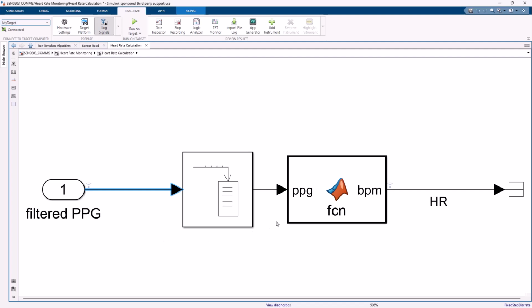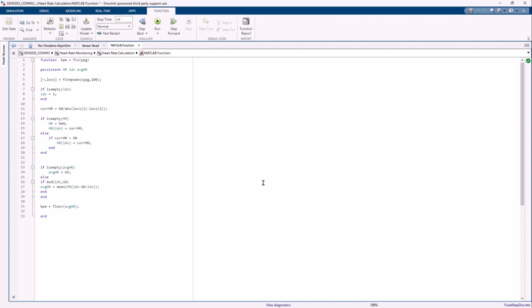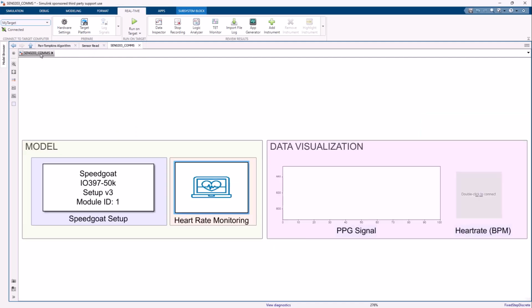Of course, MATLAB and Simulink go hand in hand, so you can also program a MATLAB function inside a Simulink block. So this Simulink-based workflow is also accessible for MATLAB code programmers, especially those coming from a background in computational biology or biomedical engineering. Now we have the heartbeats, which I will visualize here alongside the PPG signal. They will appear here on this display and scope blocks.